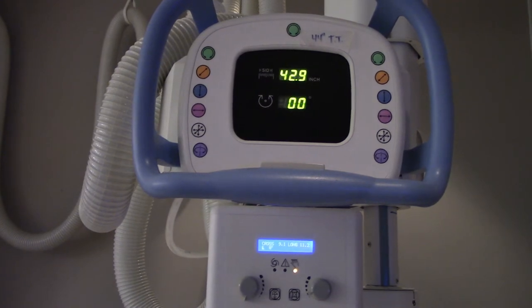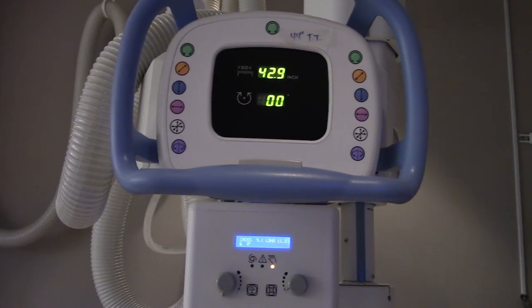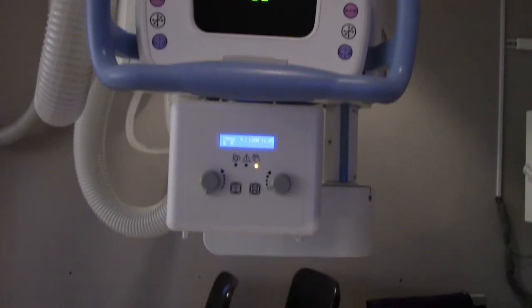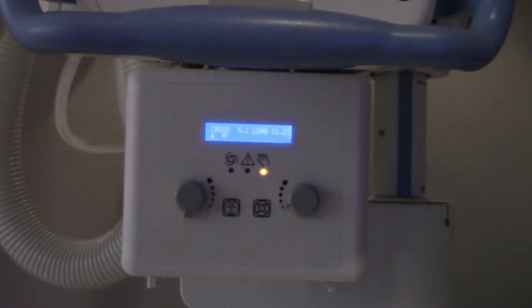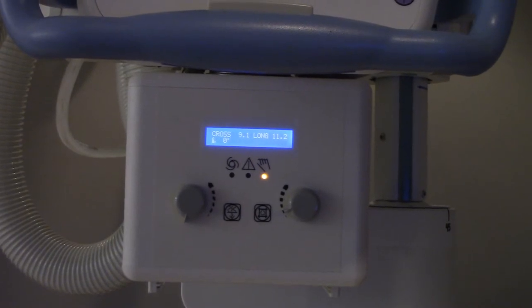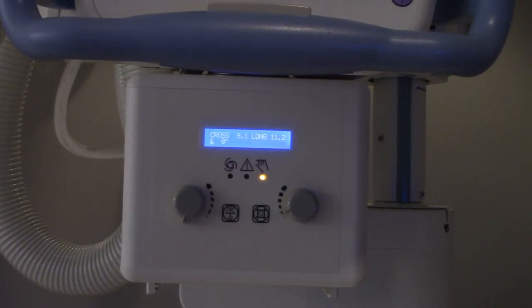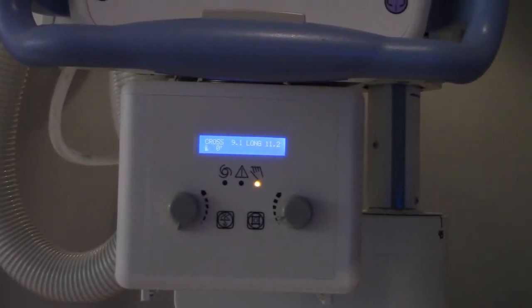We have here just a generic x-ray tube. Underneath the x-ray tube there is a device, that thing right there we refer to as a collimator. Now the collimator has a couple of dials and they control the longitudinal and the transverse width of the x-ray field, and I'll show you how that works.